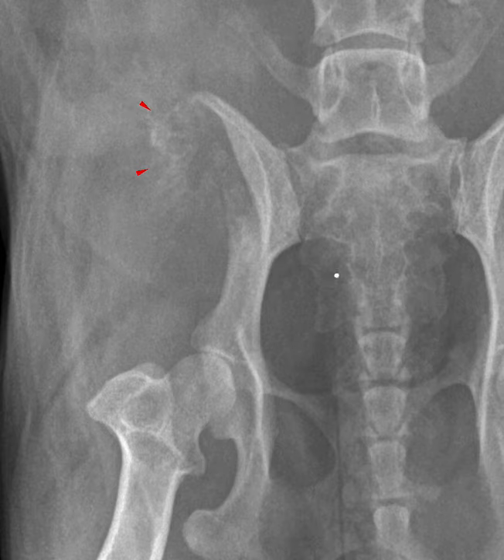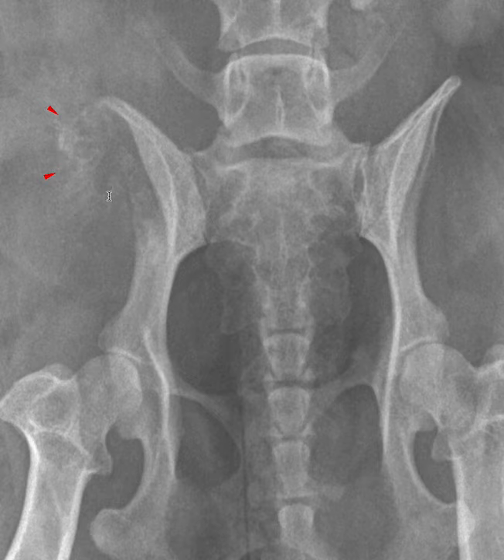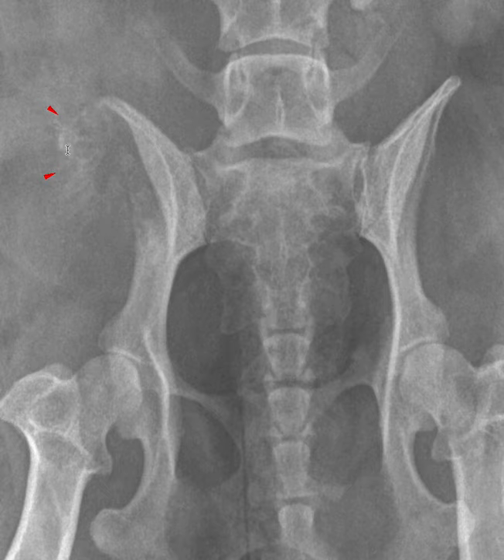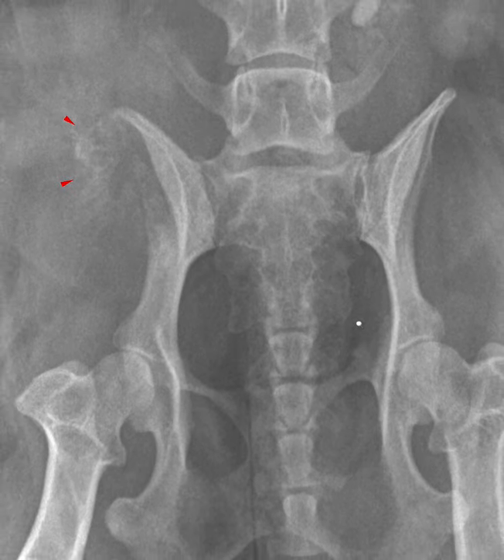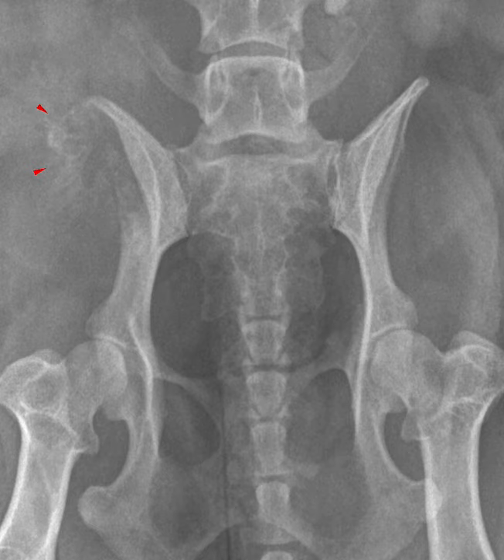For today, as we were tracing the cortex using our systematic approach, we noticed a defect. This is quite definitive for the presence of bone lysis. I see reduced opacity in this area — the cortex is in fact lost, so we don't have cortical continuity as we trace that edge of the ilium. There are other findings of an aggressive bone lesion here, such as periosteal reaction or tumor new bone formation. In radiology texts there are various categories for bone lysis. I would probably call this moth-eaten bone lysis — large areas of lucency in the bone that are coalescing. Other terms you'll hear are permeative bone lysis and geographic bone lysis.